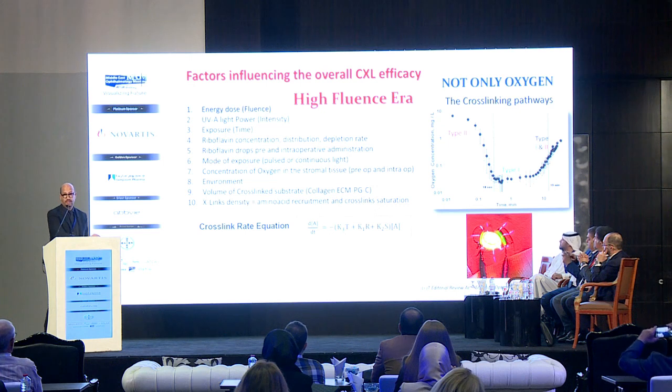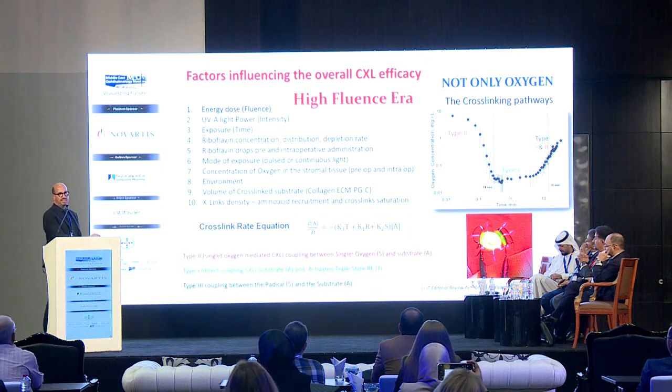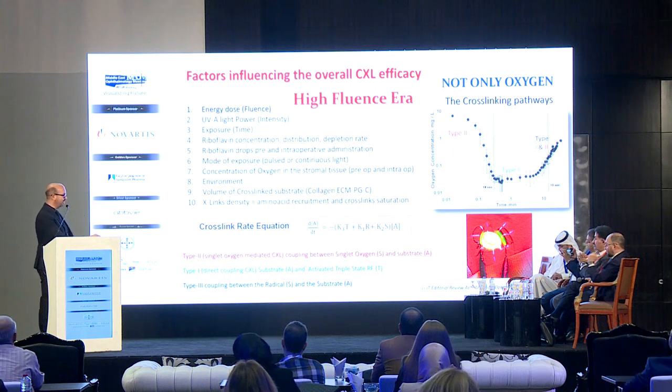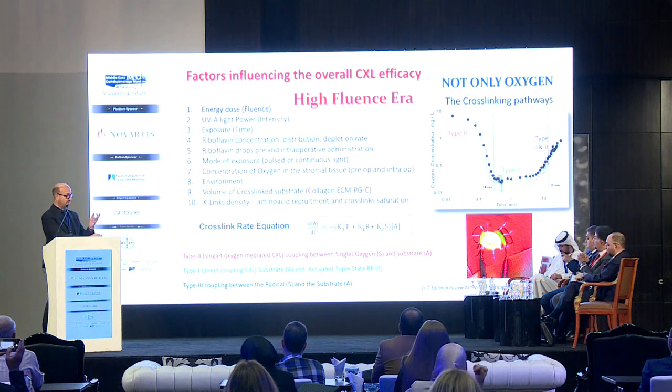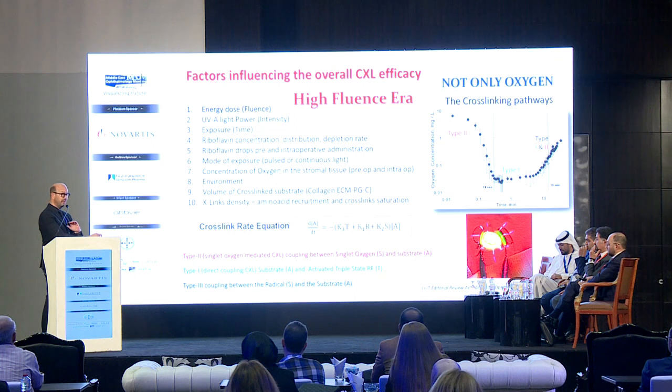You know, cross-linking is not only oxygen dependent. This is the new. We have at least 3 patterns for cross-linking. We have the oxygen-dependent cross-linking, that is the type 2, that is the most powerful pattern. But we may have cross-linking in a low oxygen environment and without oxygen. That is the pathway type 1.